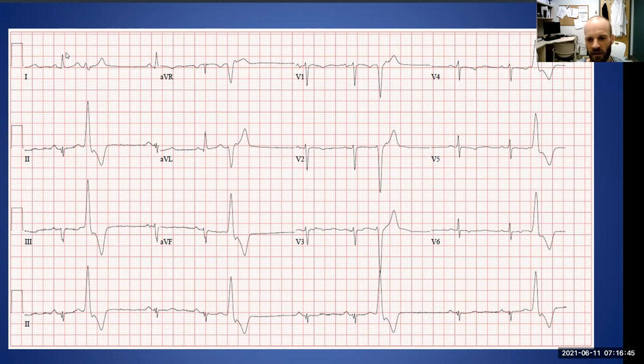So a good thing is that for most ECGs, you're recording all of these leads simultaneously, and you have this one at the top. So here we've got lead two, but we've also got lead two all the way along here. And as you can see, all of these completely line up, don't they? So these are being recorded simultaneously. Sometimes in one lead, it can look a little bit tricky to work out exactly what's going on, but if you follow it down, this is what's happening in all the other leads at the same time. And I agree, you'd be a bit concerned about what that was.